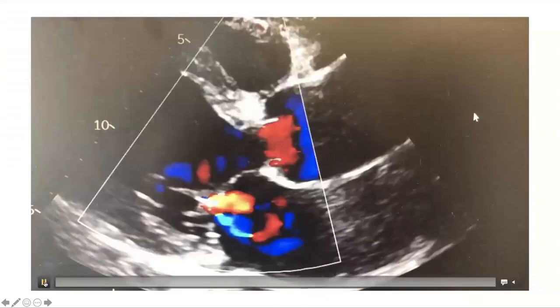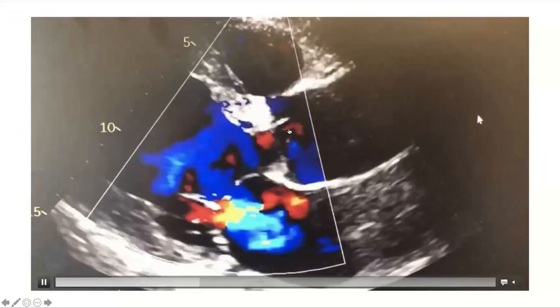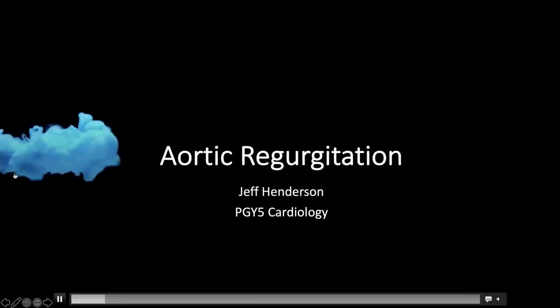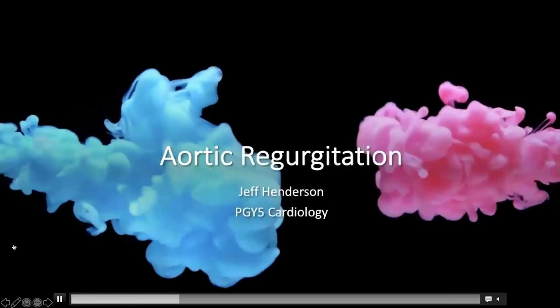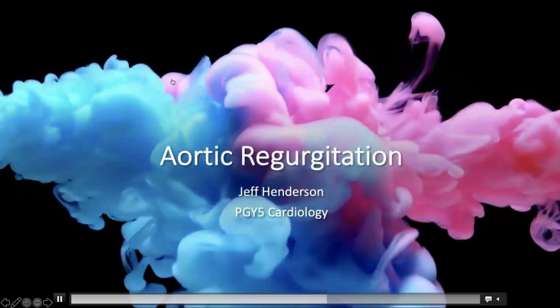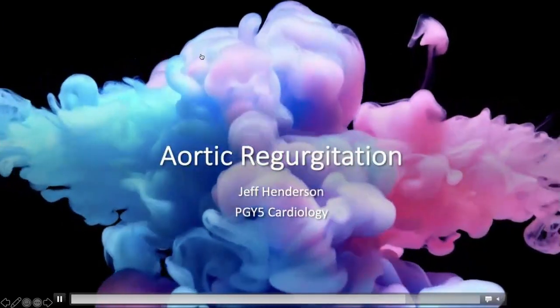So, tying this all together, you could say this talk is about MR, but it's actually aortic regurgitation. So surprise, that's what the topic is today. And so hopefully I can try to convince you that aortic regurgitation is a little bit more than just blue and red jets.